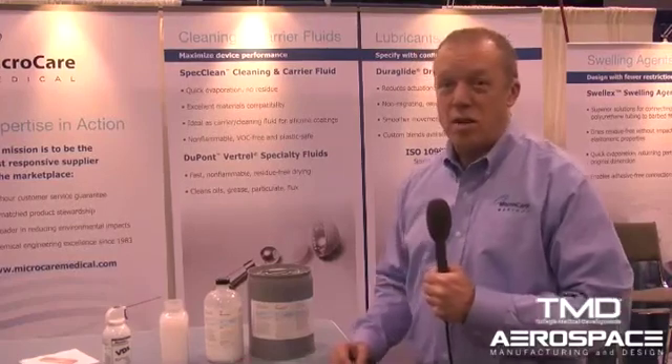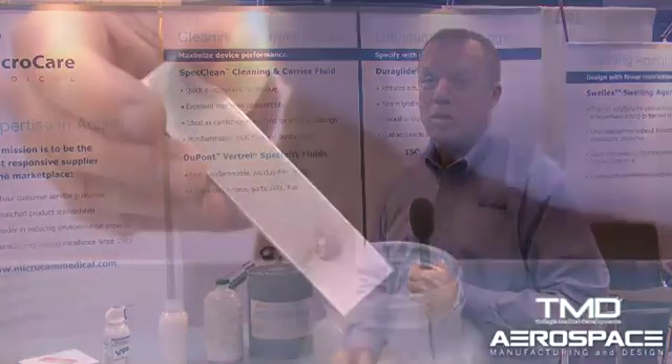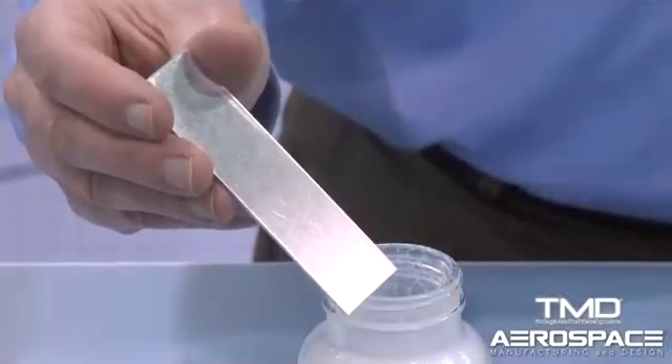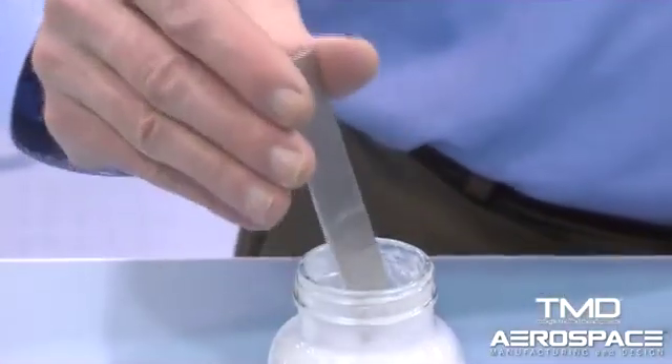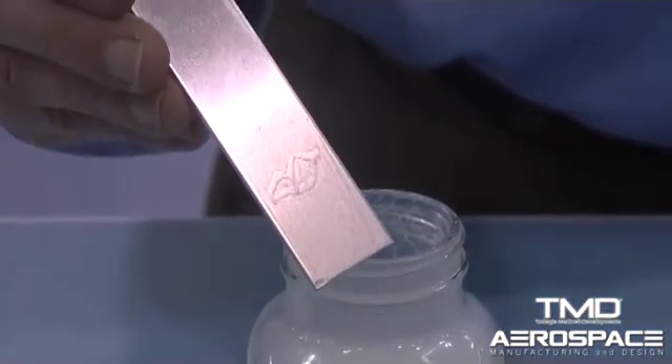Duraglide dry lubricants is a special family of dry lubricants used on medical devices. They've recently been certified to ISO 10993 and they're widely used on a lot of mechanical devices for reducing friction forces primarily caused by stack tolerances. I've got a quick demo — essentially what you do is dip a part down into the fluid. The carrier fluid dries very quickly and it leaves behind a thin uniform coat of PTFE that serves as a lubricant for the product.